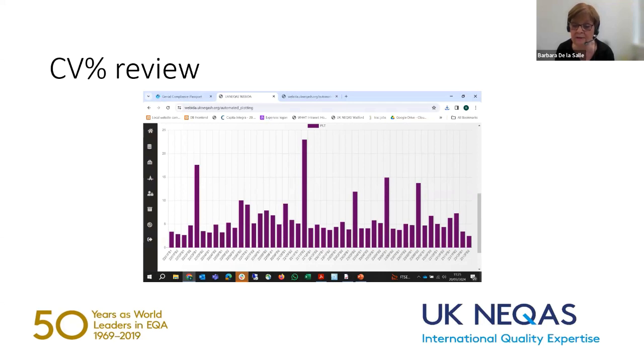That does take time, and that sometimes is why your reports don't come out within 2 days, which is what we aim for the full blood count. Sometimes we do have to do a little bit more delving into the data to make sure that the report is adequate.